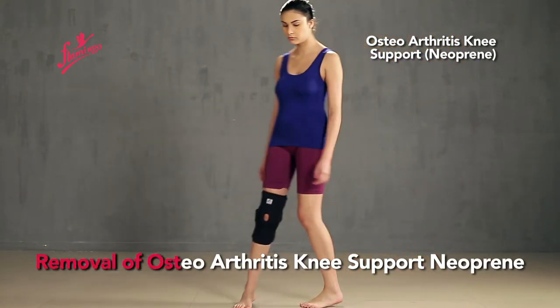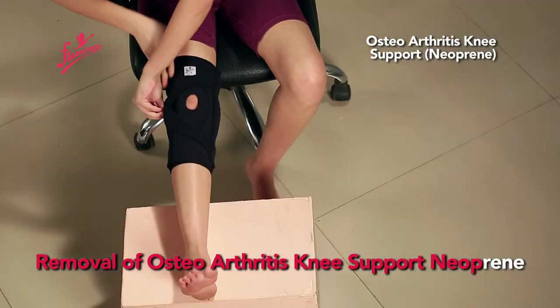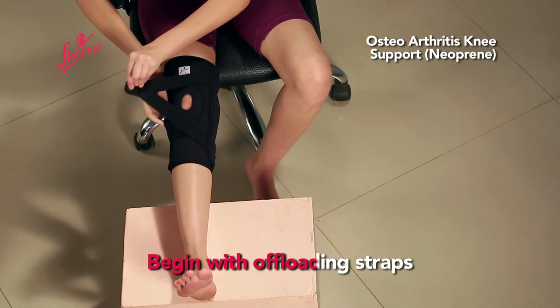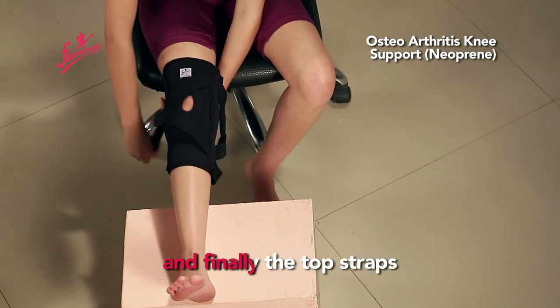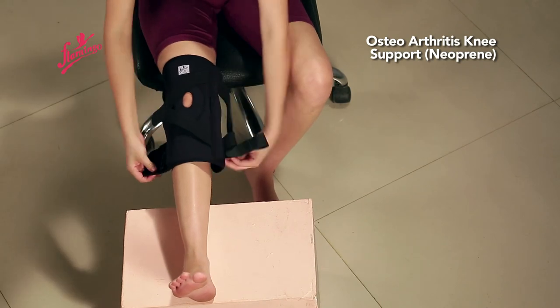Removal of the Osteoarthritis Knee Support Neoprene: begin with the offloading straps, followed by the bottom straps, and finally the top straps.